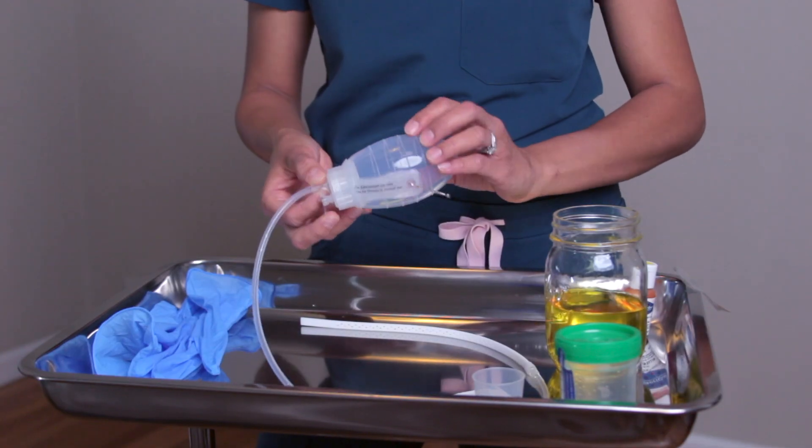And then this is the JP bulb. Per textbook, they may refer to it as a reservoir. Sometimes I've also heard it called a grenade — I'm curious to hear what you call it.